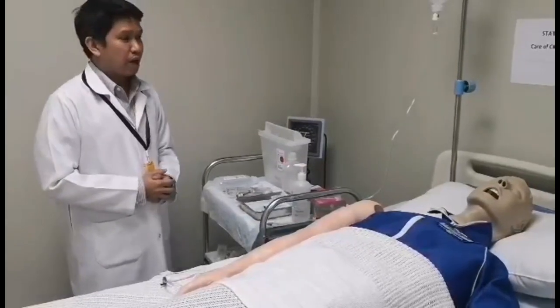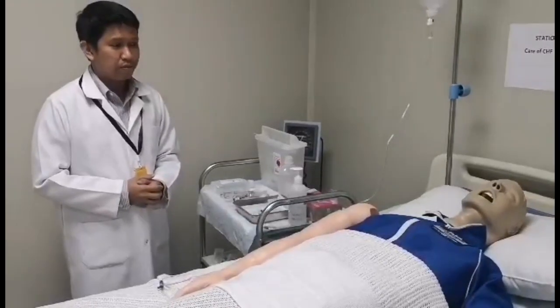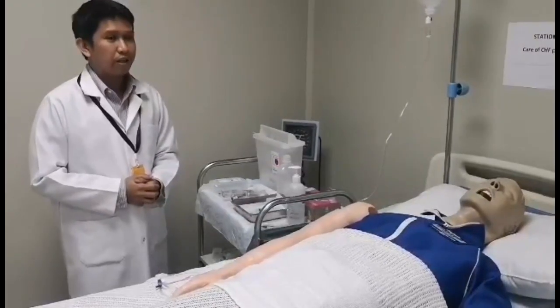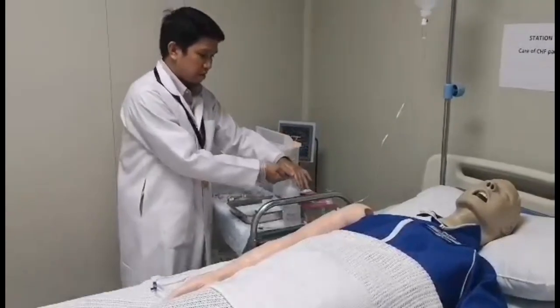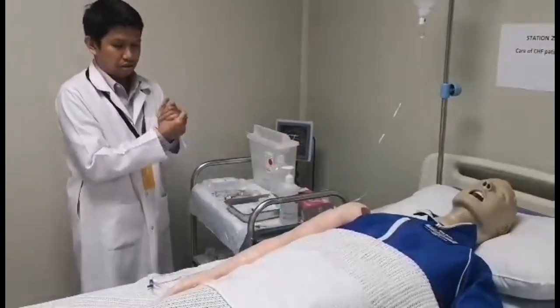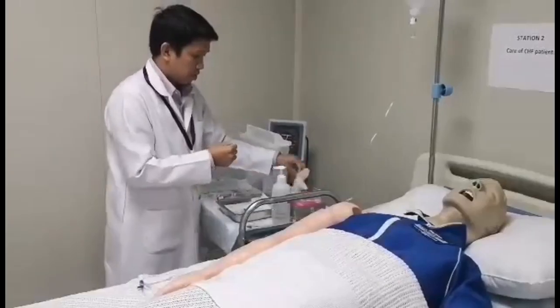Mr. Muhammad, today I will give you some IV medications. Would that be fine with you? Thank you very much. And then you need to wash your hands and put on the gloves.